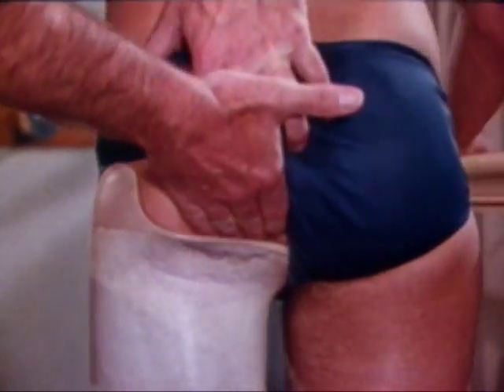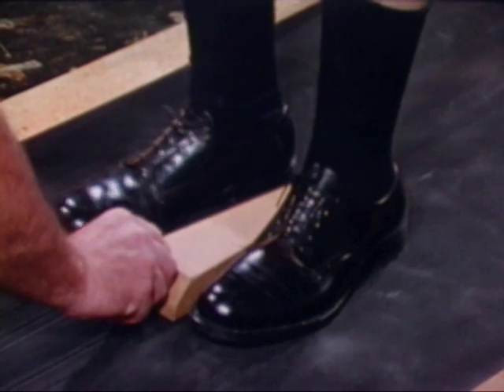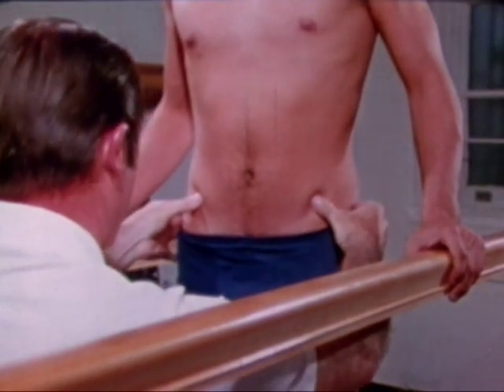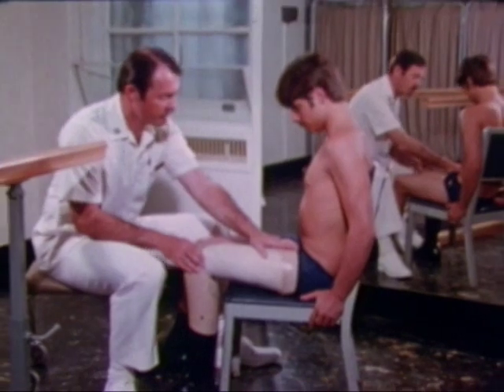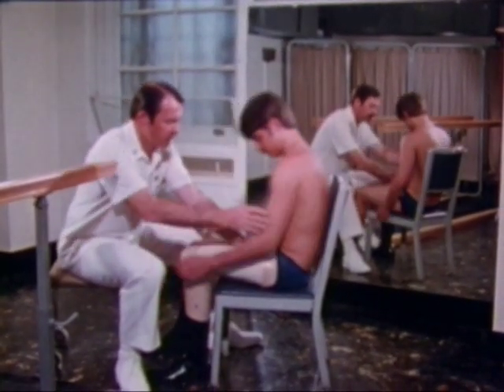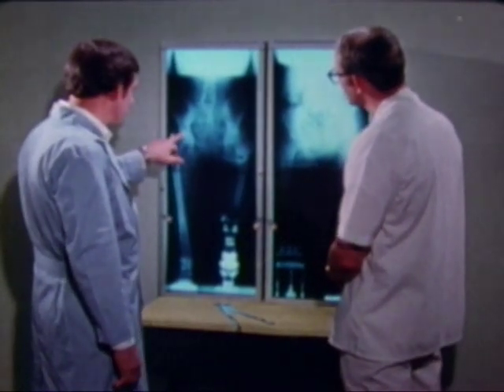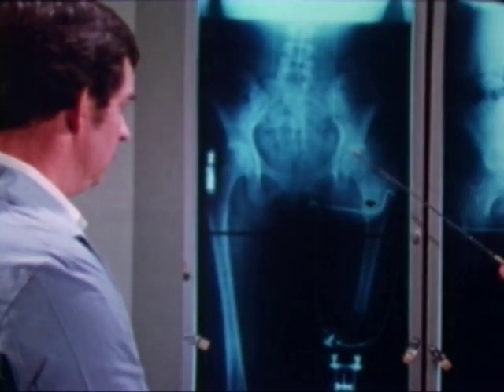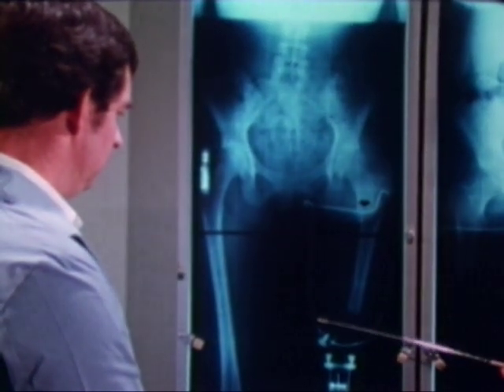Check the ischial seat position by having the patient lean forward, then palpate as he straightens up. Is the pelvis level? With his weight evenly distributed, see if the anterior superior spine of the ilium is the same height on each side. Finally, is the anterior wall too high? If he can sit comfortably, the height is acceptable. At hospitals where specialized x-ray equipment is available, you can obtain plates to help evaluate the fit. Major points to be considered are the position of the ischial seat, acceptable height of the femoral heads, equal femoral adduction, and total contact at the bottom of the prosthesis.